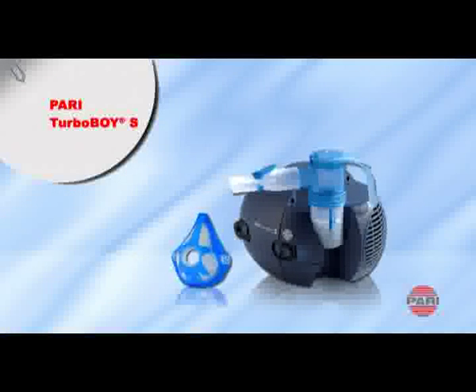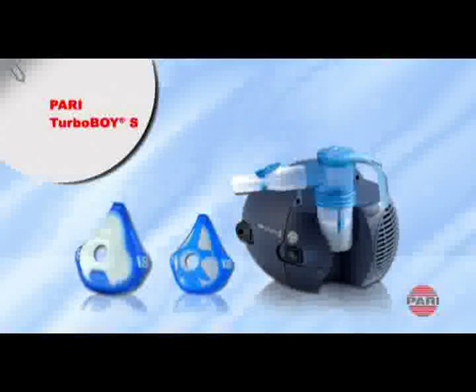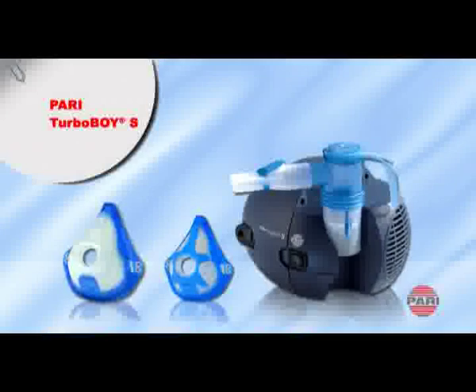An adult mask is also available as an option. Press the mask gently but firmly over the mouth and nose and breathe in and then out again through the mask as described for the mouthpiece.